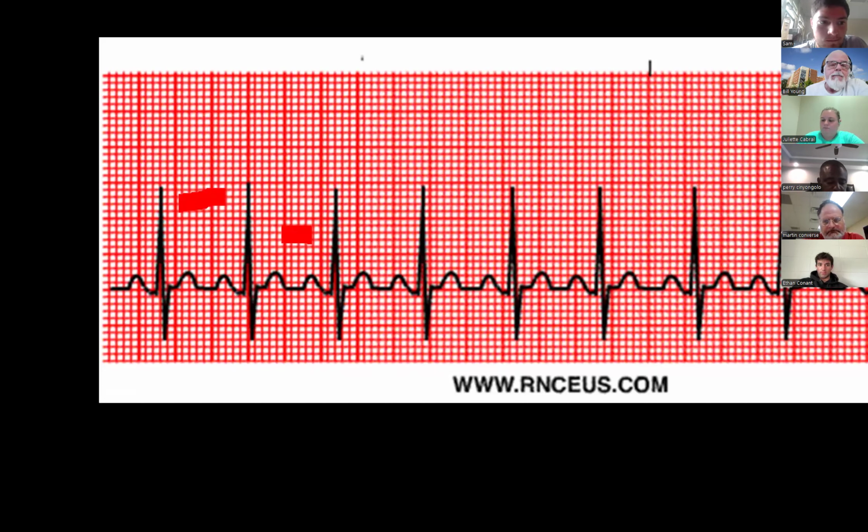Yeah, it looks like it's about 3 boxes. I could go with that. Good. Good answer. Staying right here, Ethan. What about the QRS? Does it look to be normal as well? Yeah, it's maybe 1 box, probably half a box. I can go with that.